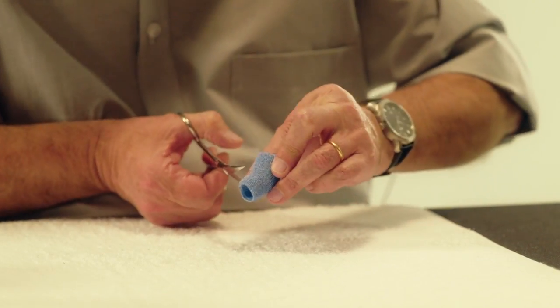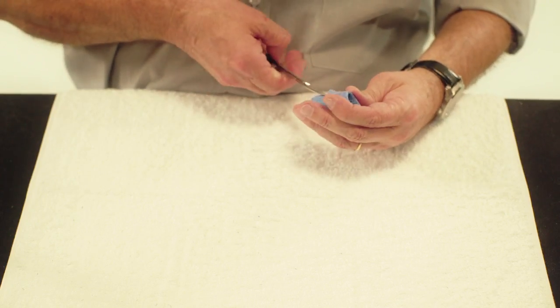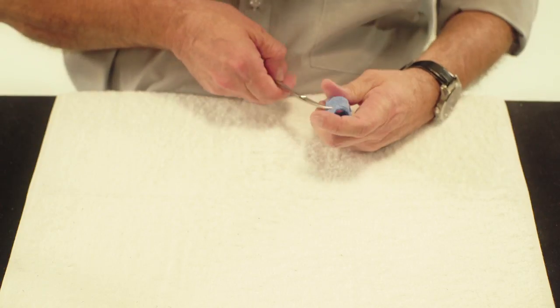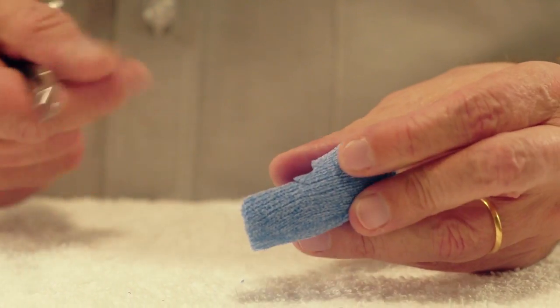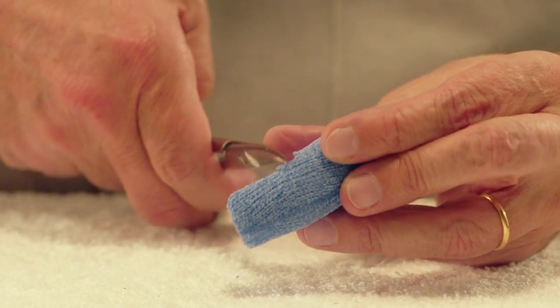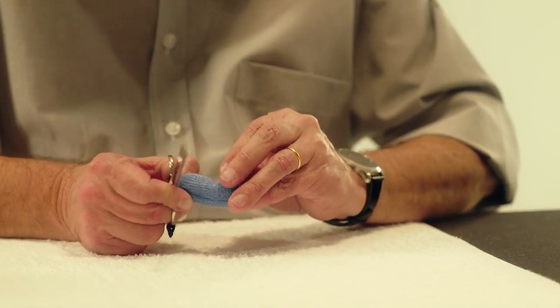Trim an opening on the palmar surface of the orthosis to free the flexion crease of the PIP joint. Cut a small V-shaped piece at both lateral edges of the opening of the PIP flexion crease.